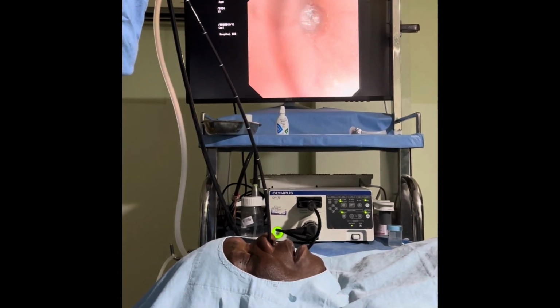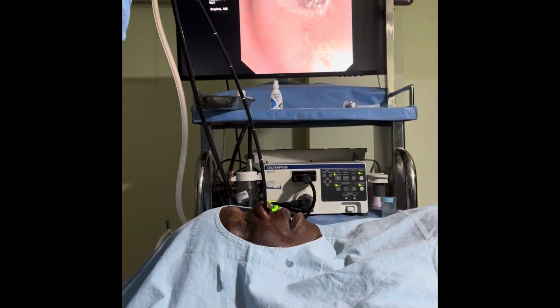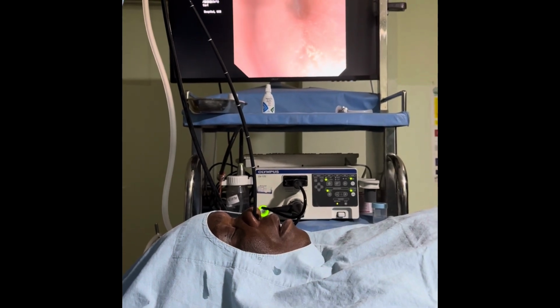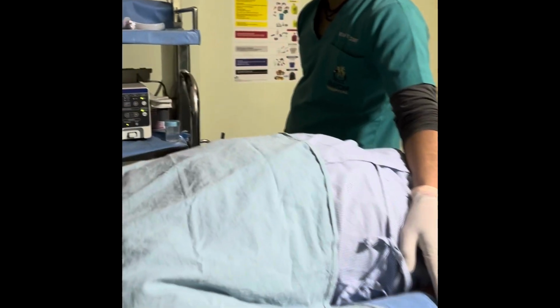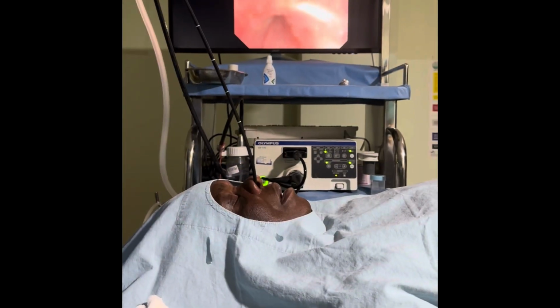Right? Again he has gone into apnea. When you go into apnea, snoring will stop, his breathing will also stop. There may be some paradoxical abdominal movements. Focus on the chest and abdomen, his breathing has also stopped. And if you look at the abdomen, there are now some paradoxical movements.